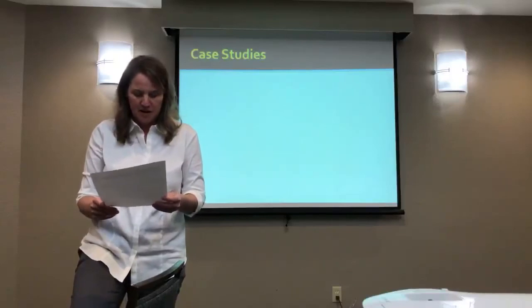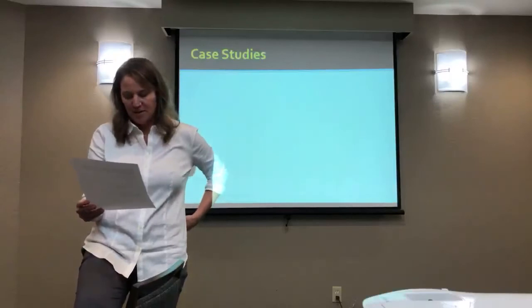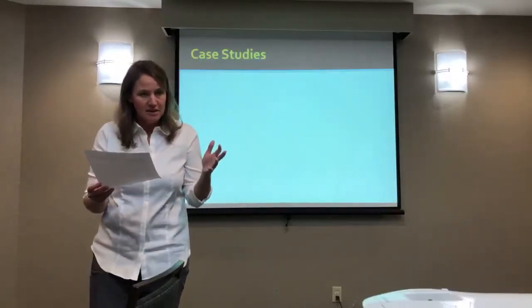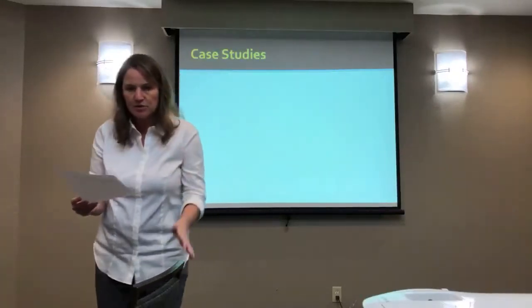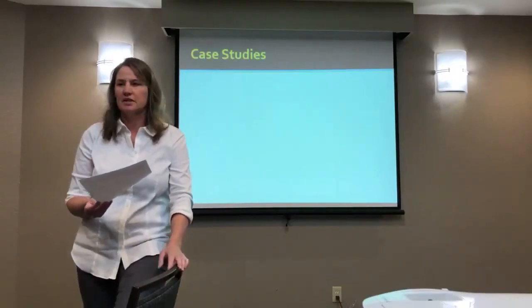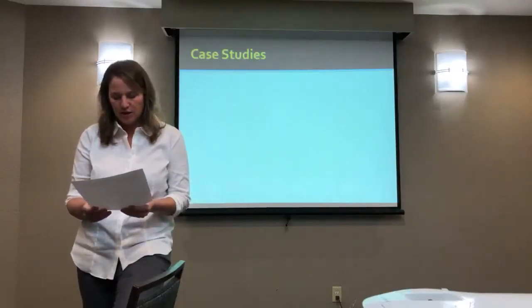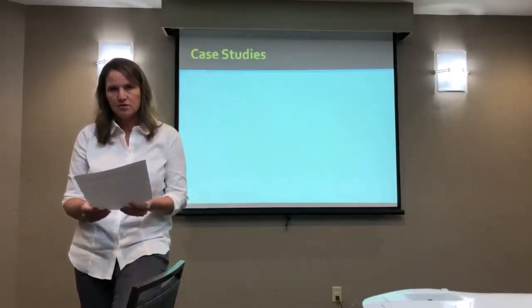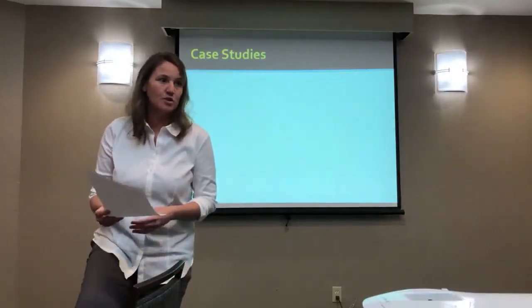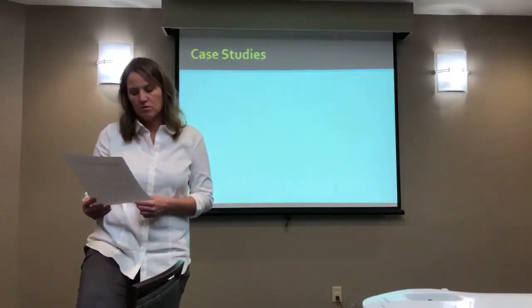All right, moving on. Oh gosh, I gave this person lateral epicondylitis. Here we go for more of this. So basically, this person has chronic, same idea, but they absolutely come in saying this keeps happening, it keeps coming back, or I've been having this for months and I just can't get over it. What do you think there? Would anything change about your treatment? I would definitely use thermal, and also definitely stretching. This is where I would do the stretch, at this point.